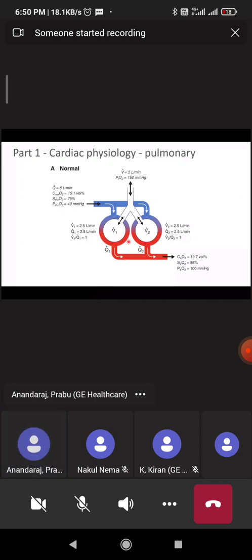Suppose I'm ventilating a pediatric patient at a tidal volume of 80-90, and I am using a pediatric circuit, but I am using an adult HME. Will it increase the dead space? Where are you connecting that? At the close to the white piece?